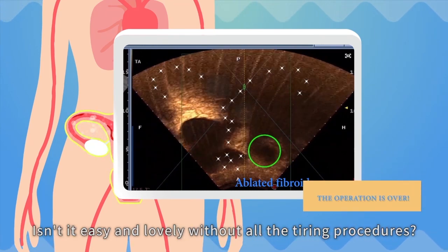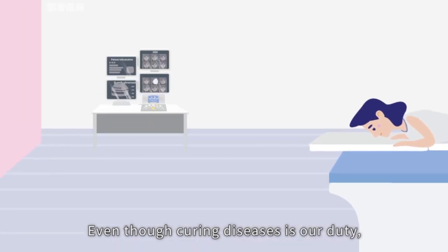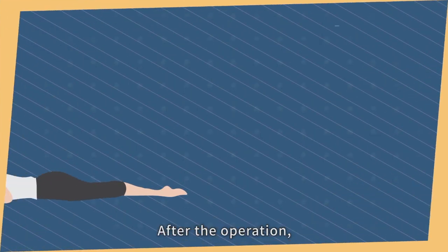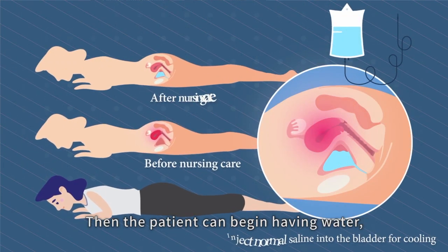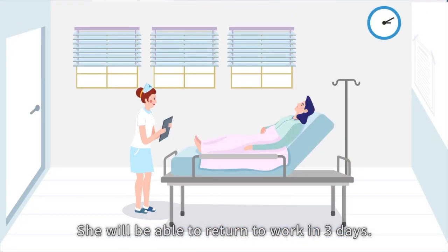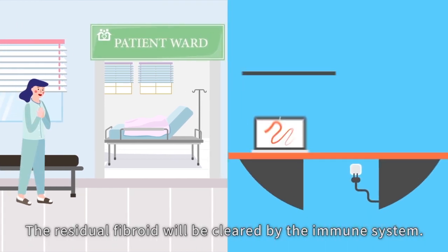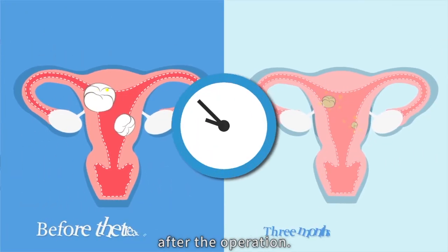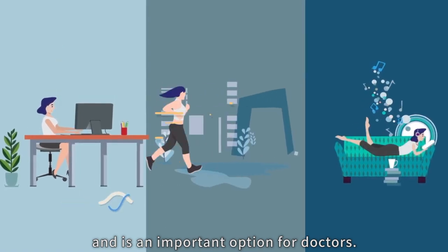It's easy without all the tiring procedures. After the operation, nurse the uterus for two hours by cooling it down. Then the patient can begin having water, food, and moving around. She will be able to return to work in three days. The residual fibroid will be cleared by the immune system, and the patient will be able to get pregnant three months after the operation. The HIFU knife means hope for patients and is an important option for doctors.